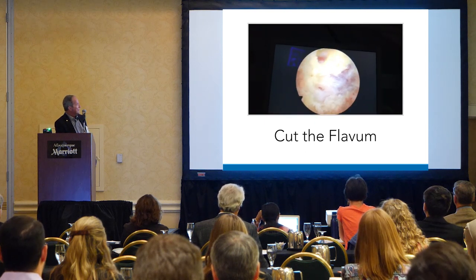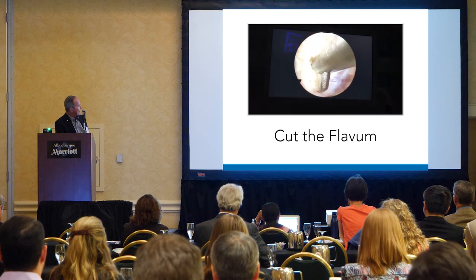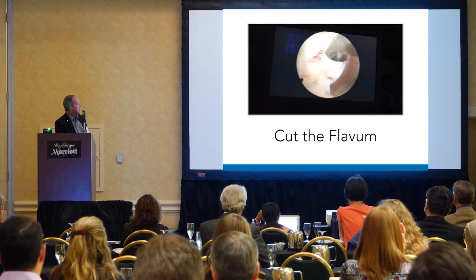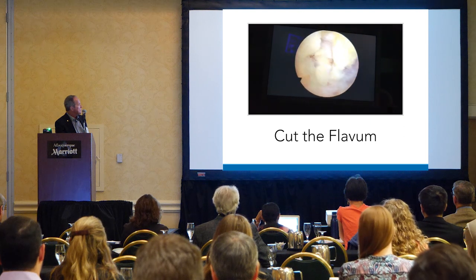Here we're going to cut the flavum now. We've made the interlaminar space big enough, and we've lateralized it. There's the flavum there, some little basket forceps, and we can immediately see the dura right there in front of us.